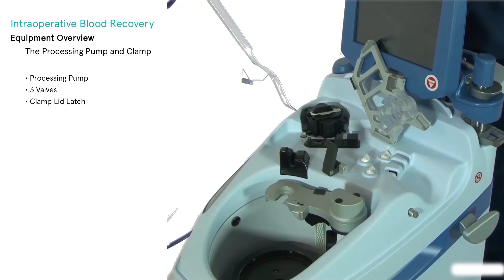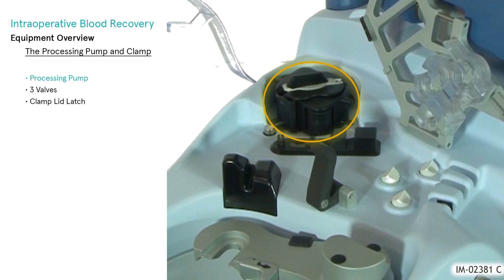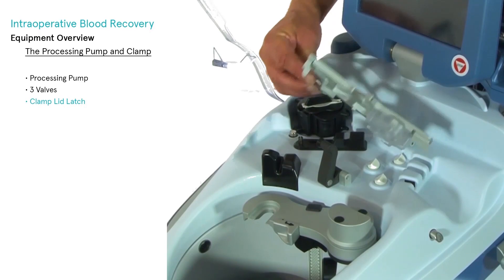The processing pump moves fluids into and out of the centrifuge bowl while providing optimal flow rates. Three valves are used to control the flow of fluids during normal processing of blood; the valves determine which fluids are routed at each processing phase. The clamp lid latch closes over the valves.